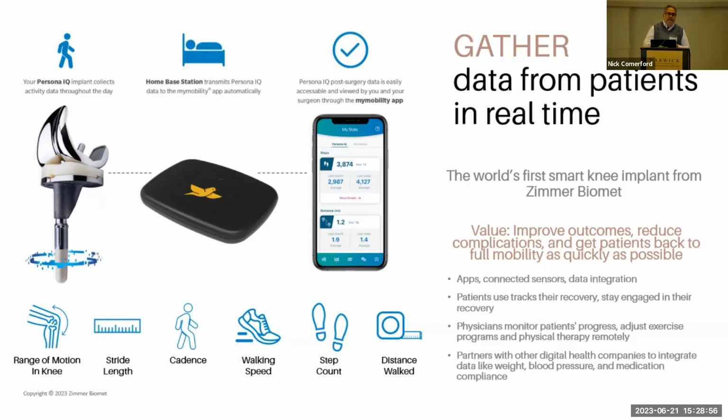So as you start having these devices that expand and have connectivity, the user environment we were talking about earlier becomes more important. And there's nothing more complex about the user environment than actual Wi-Fi connectivity, Bluetooth connectivity, and so forth. And then the other issue I put up on the screen, I so want to move over there and get away from this podium, is the value. There were some discussions earlier around the value proposition, which is the outcome.